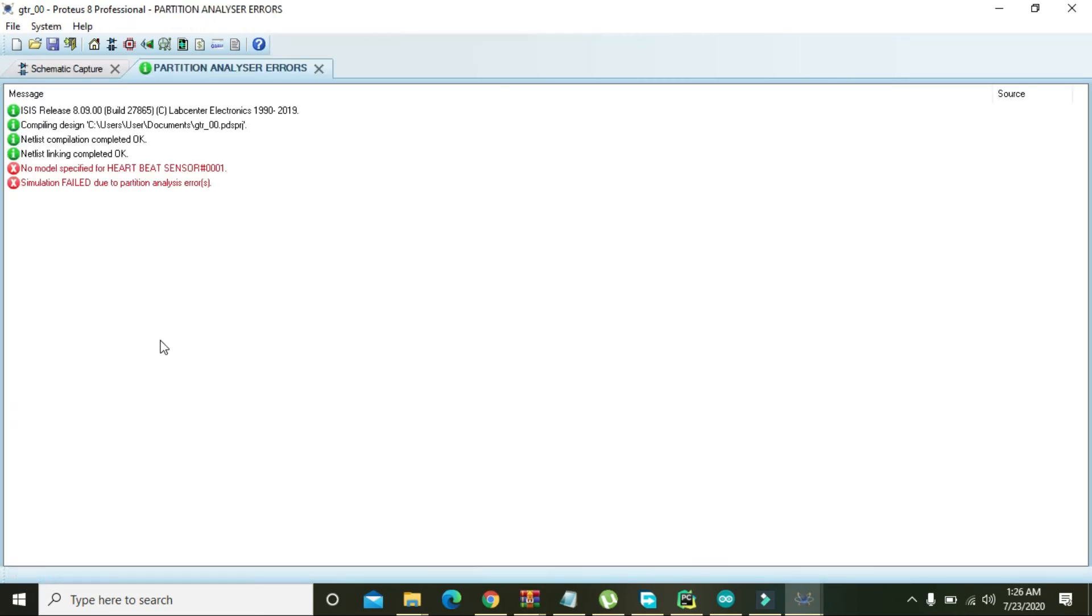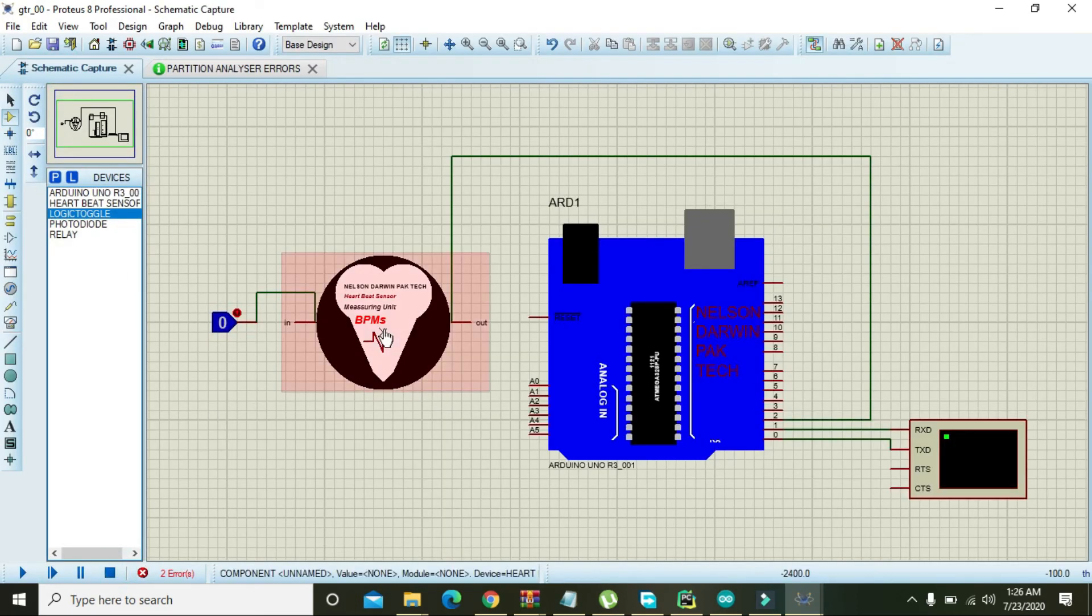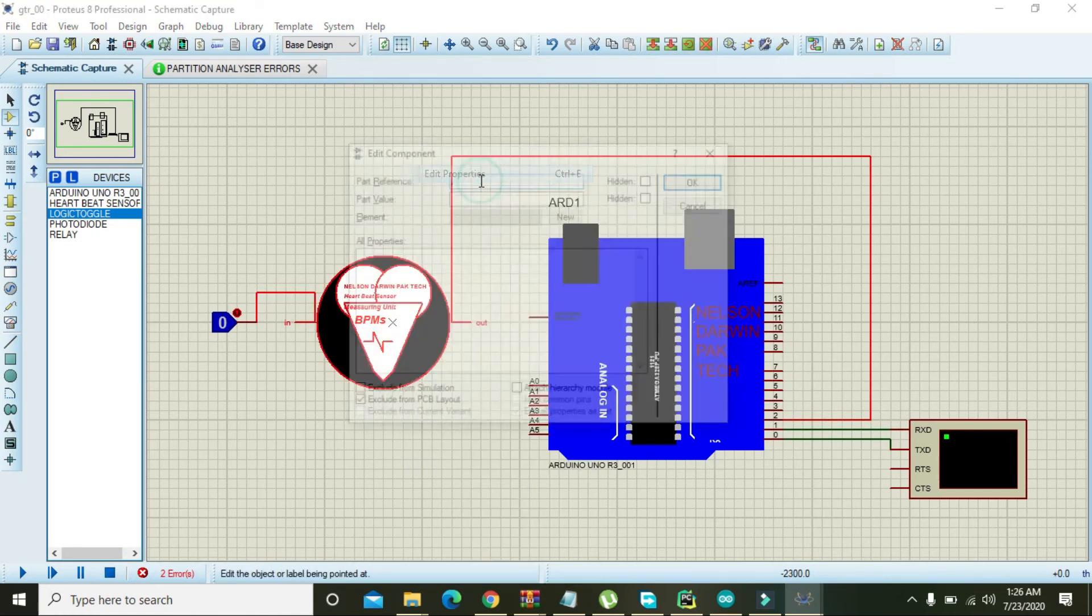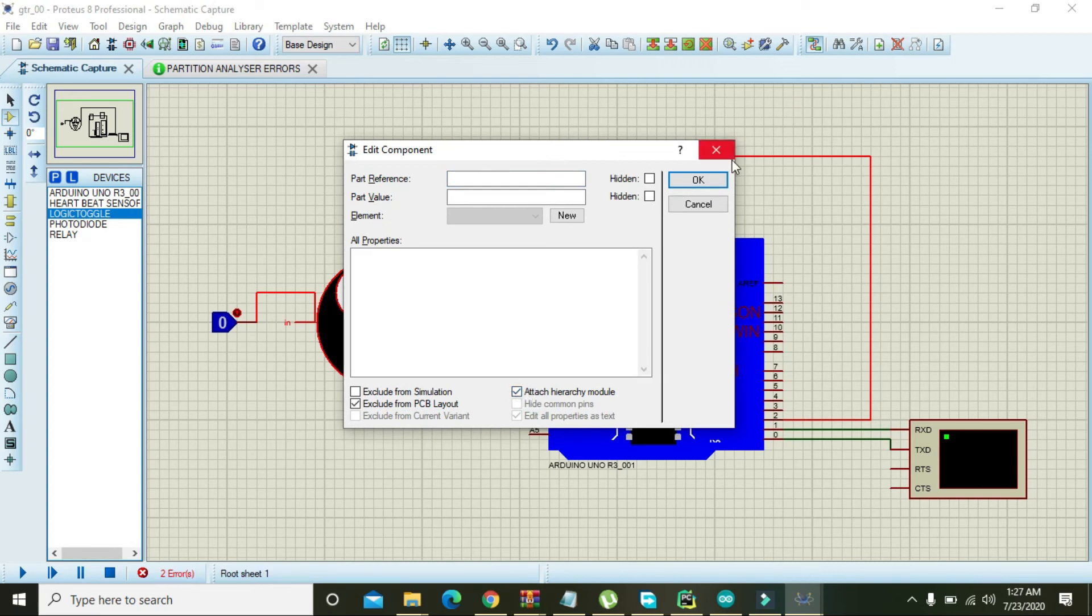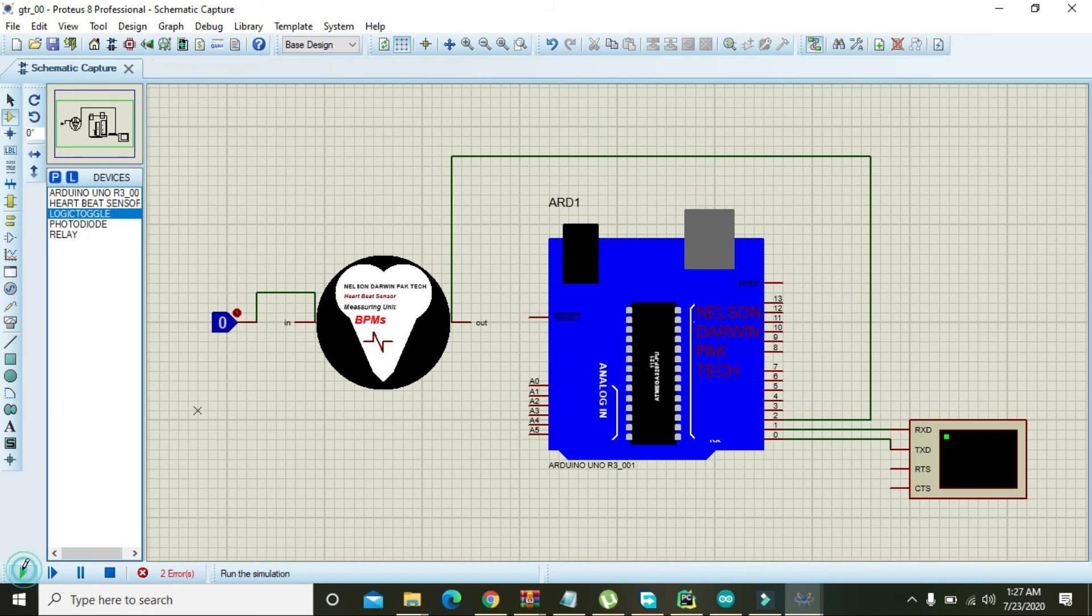And okay wait, there is one mini problem. Right click on the heartbeat sensor, go to edit properties, and tick this one: attach hierarchy module, and press OK. And now we will run it.